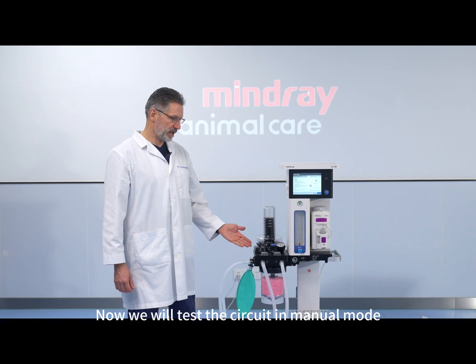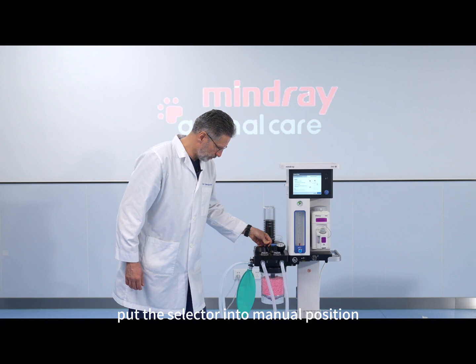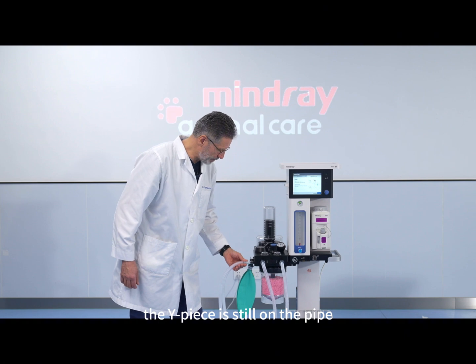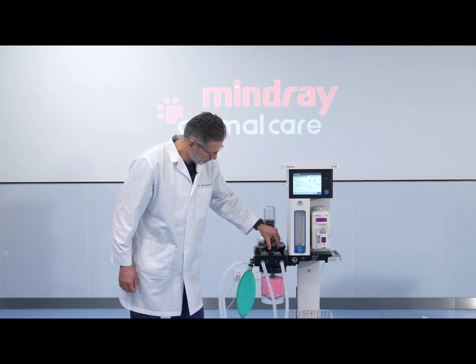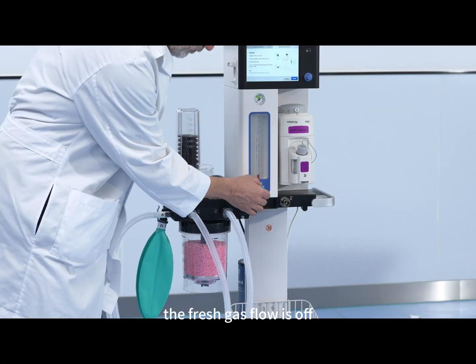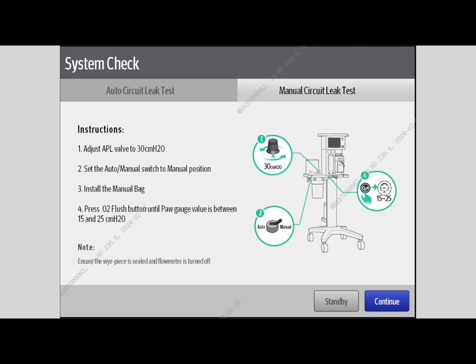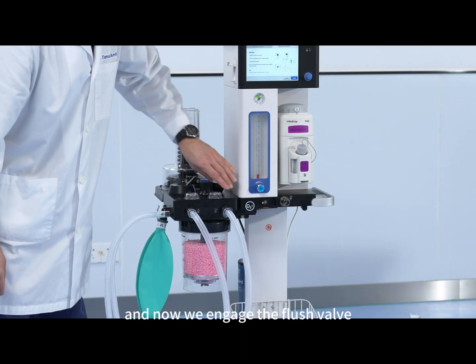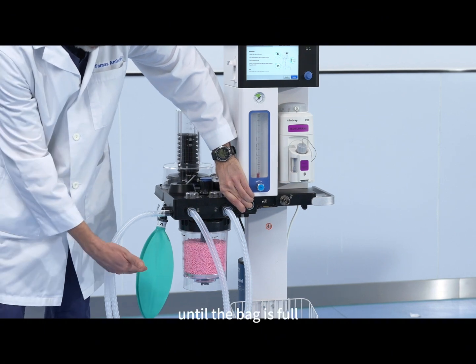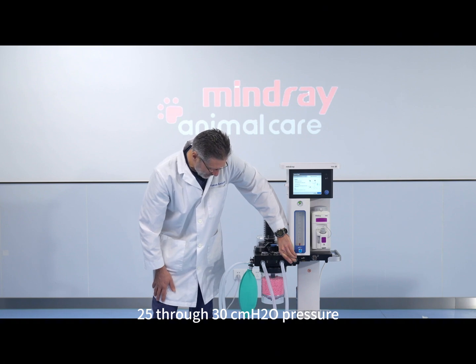Now we will test the circuit in manual mode. Put the selector into manual position, make sure the bag is attached nice and firm, and the Y-piece is still on the pipe. Turn the APL valve to 30 cm of water, the fresh gas flow is OFF, and the ACGO selector is also in the OFF position. Now we engage the flush valve until the bag is full, filling it up to about 25 or 30 cm of water pressure.